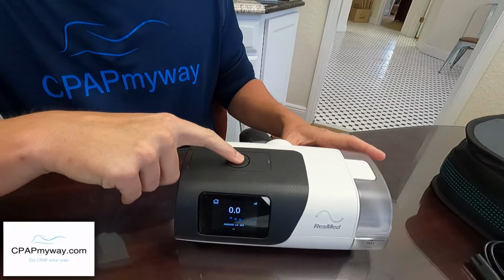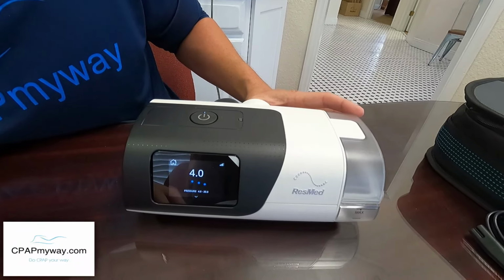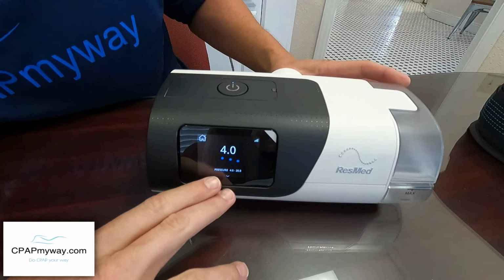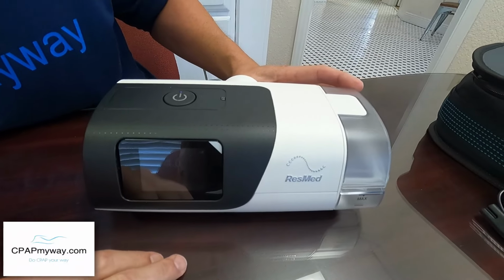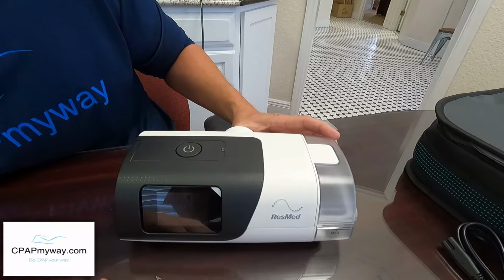So to turn it on, we just press it 1 time. You'll see the digital display come up, and it will go to your prescribed pressure. It tells you down at the bottom what your pressure settings are. So pressure range 4 to 20. It does go dim pretty quickly, obviously. You don't want it too bright in your room.